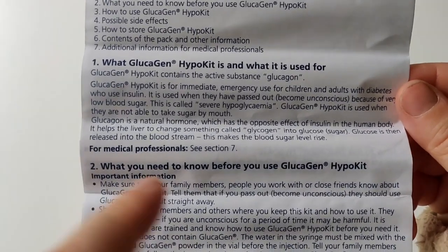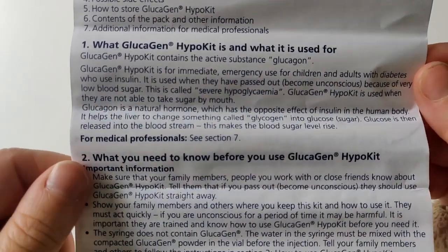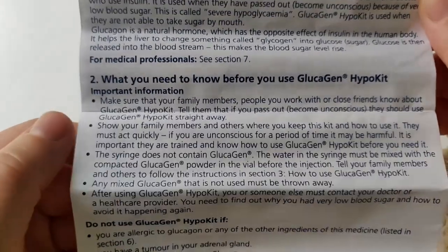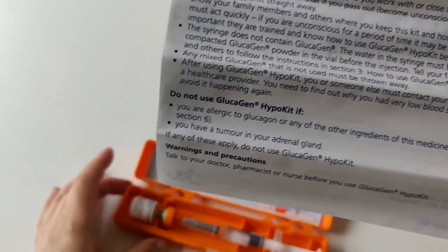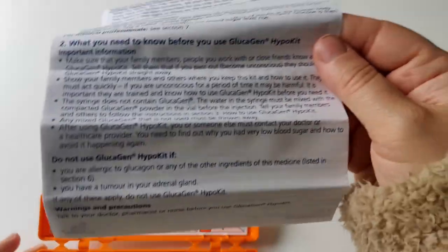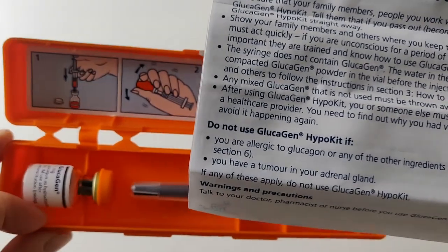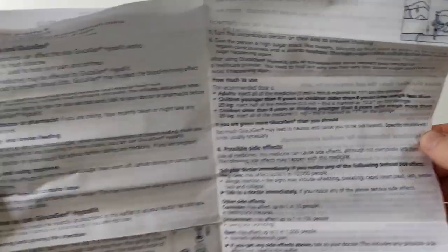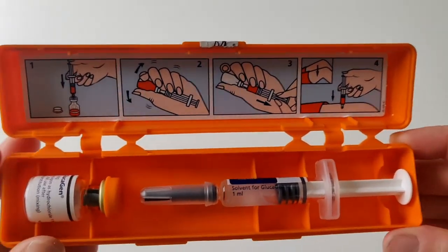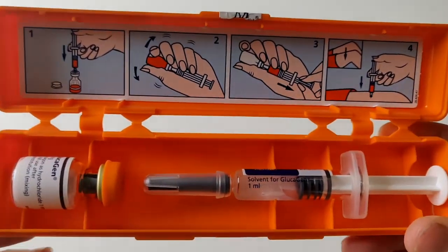The leaflet confirms it's used when a diabetic has become unconscious due to low blood sugar. Make sure your friends and family are aware and trained to use it. Importantly, there is a syringe and a vial — the syringe does not contain any glucagon. The water in the syringe has to be mixed with the glucagon powder in the vial, so you cannot just inject the syringe alone; you must use the vial as well and draw it up as shown.